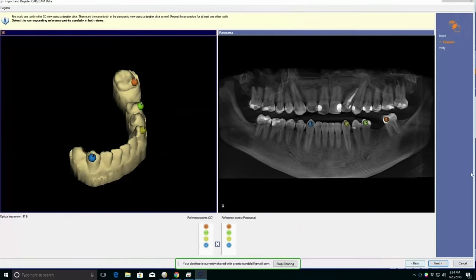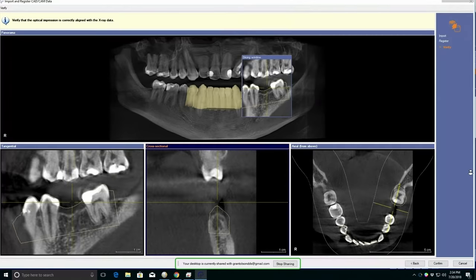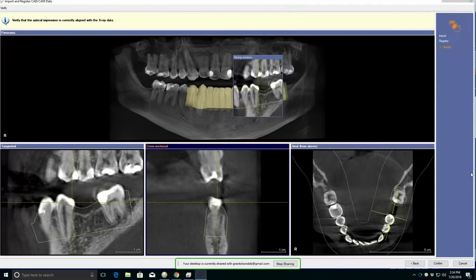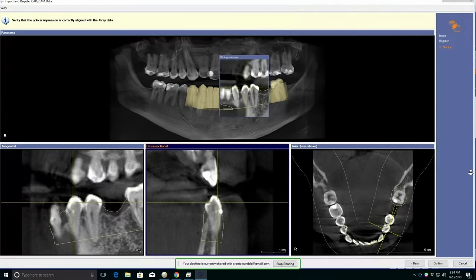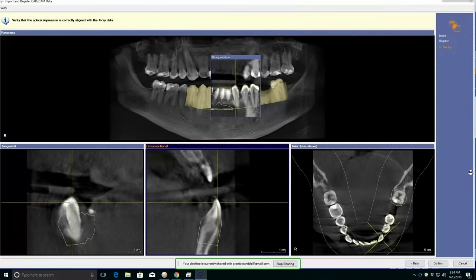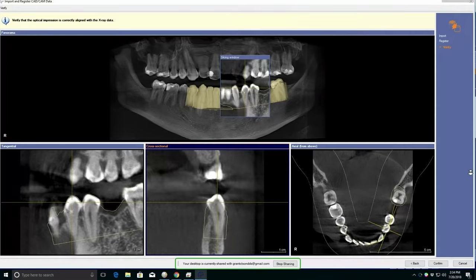It's obviously two-dimensional there, but you can see how those parts meet up. The computer, after telling it that, will take and put them together, and then I get to go and try to verify and make certain that that is a correct orientation of that stitch, is what we call it. It's where the model fits over the x-ray, and you can see there that yellow line perfectly follows the contours of Trey's teeth there in the 3D x-ray, so we know we are in good shape.